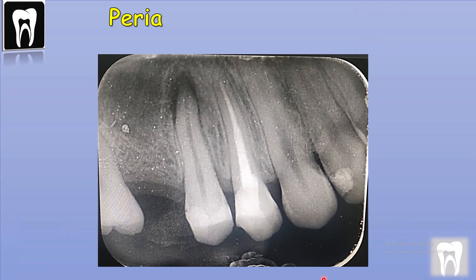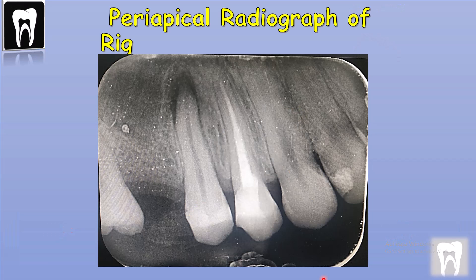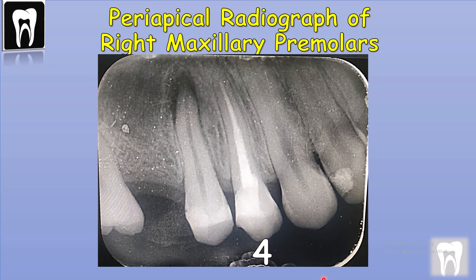This is a periapical radiograph of the maxillary premolars. We can see the maxillary premolars, the crown, the root, and the lamina dura and the periodontal space, and the surrounding bone.